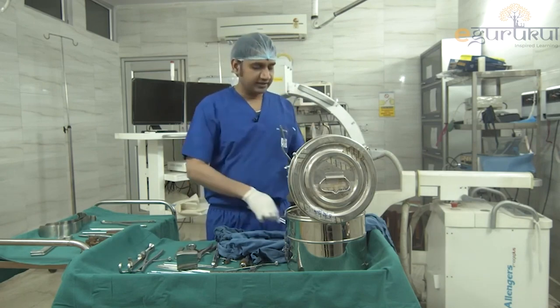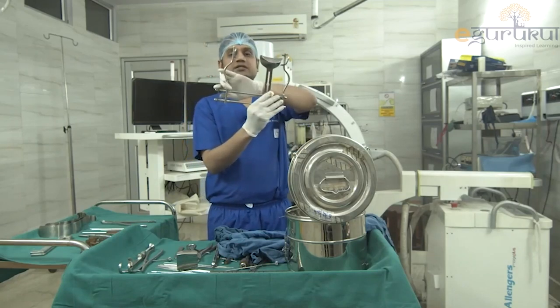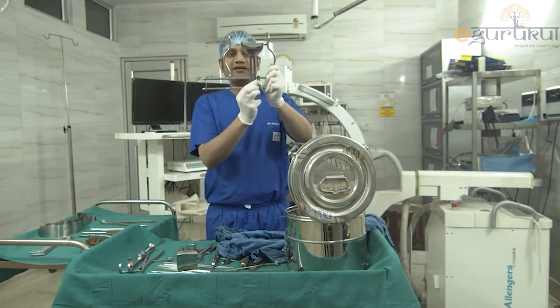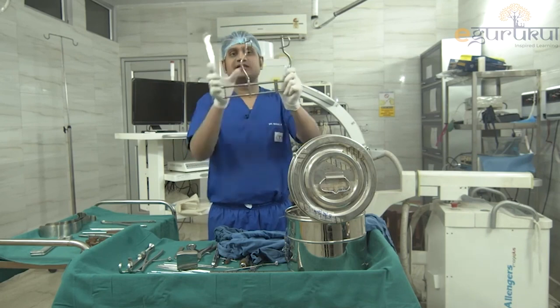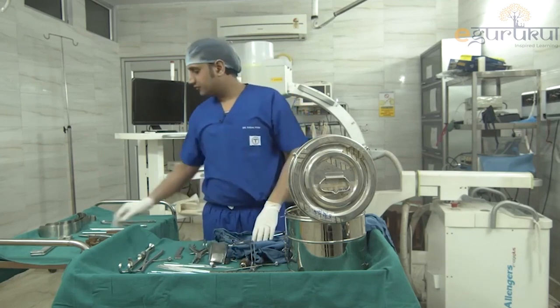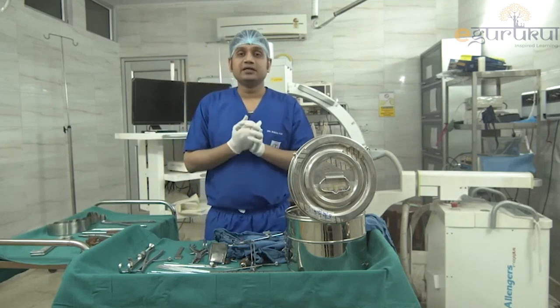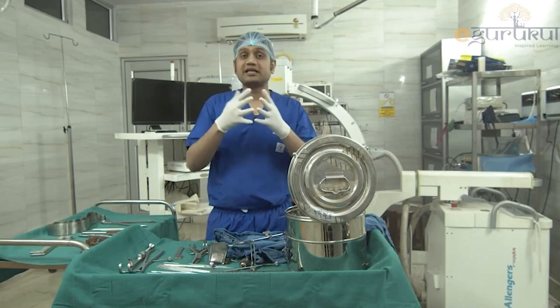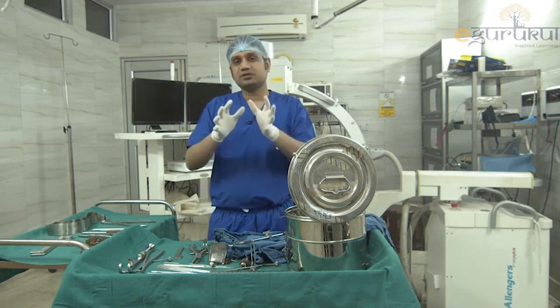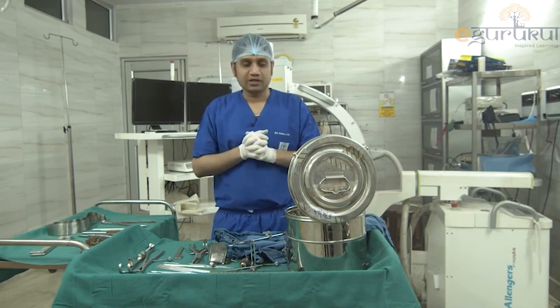Also shown is a self-retaining retractor — you fix it on both sides and it maintains tissue retraction at a set position, continuously retracting the soft tissue. The Langenbeck and Zerny retractors are currently in the autoclave and could not be shown.